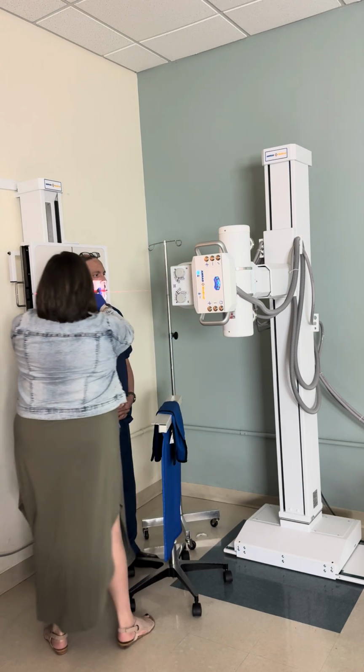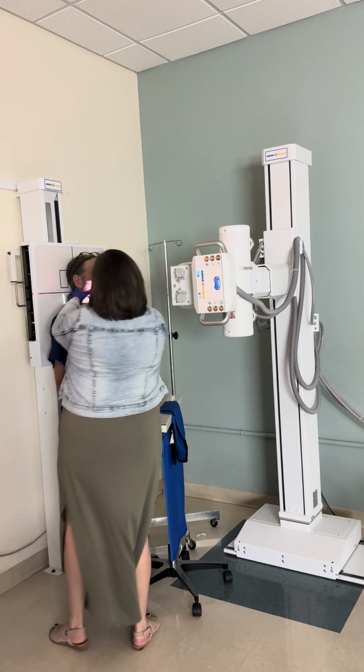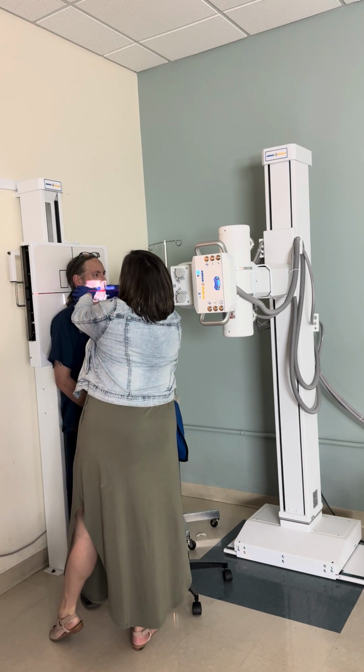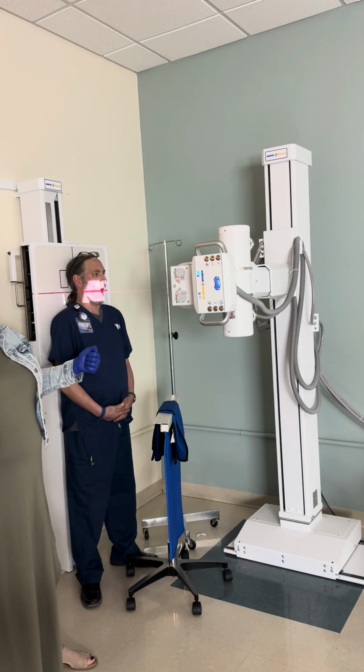So right here is his upper tooth, and here is this, and we have a straight line coming through. Now it's important that you hold your patient's head in place and then tell them to go ahead and drop their jaw open as much as they can. Good, and then they say, ah, and we take an x-ray, okay?